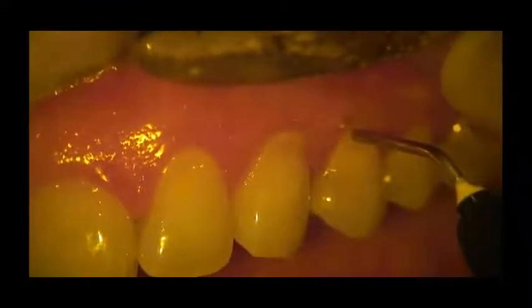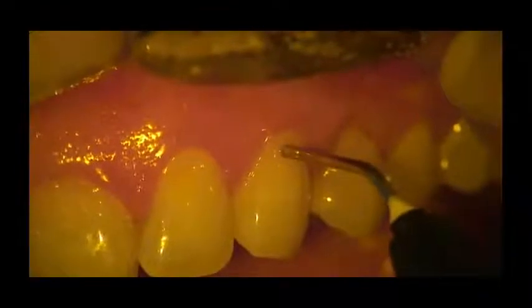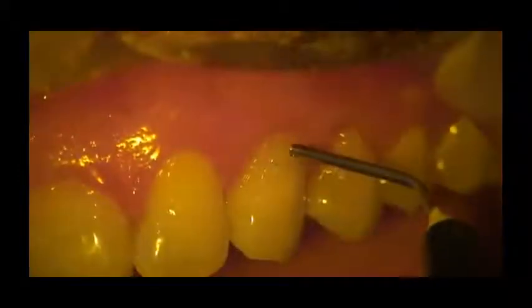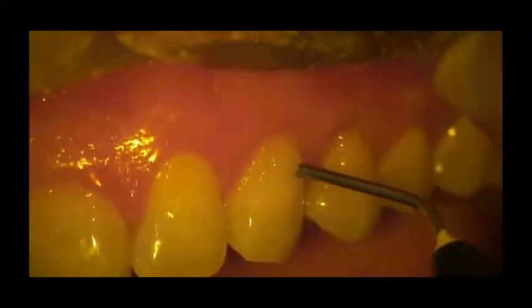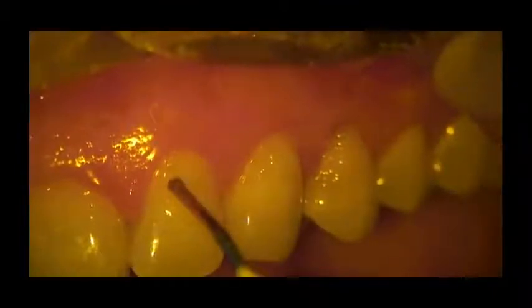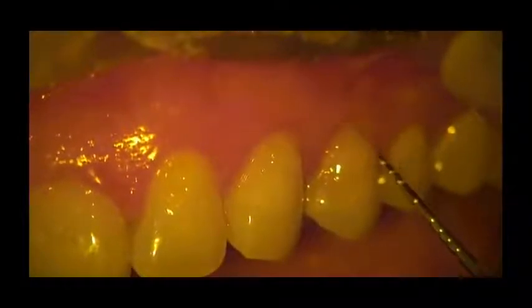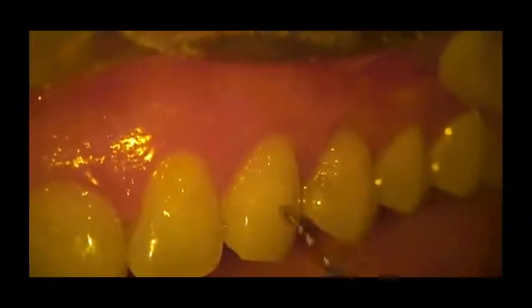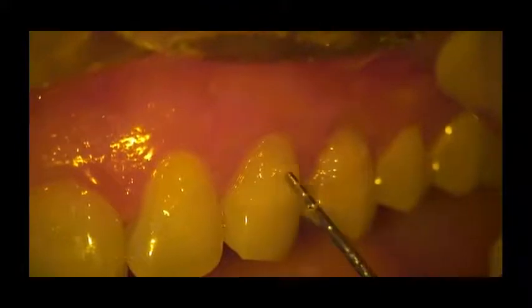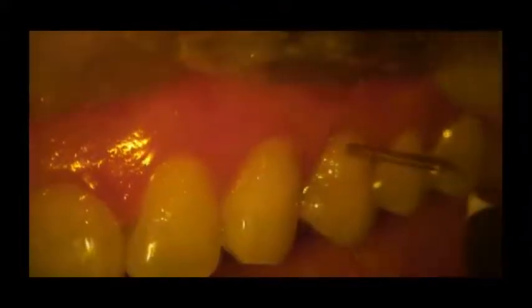So here's our flowable microfill. We're just going to put a little bit of this on and let it flow around, light cure it. And I layer this incrementally, so I'm adding a little bit more. And if you look at it, it has a really good amount of flow to this product. So it flows nicely, it's not too runny, and it's not too thick. So I find it's perfect for class 5 defects. And I generally just move it around a little bit with a periodontal probe.